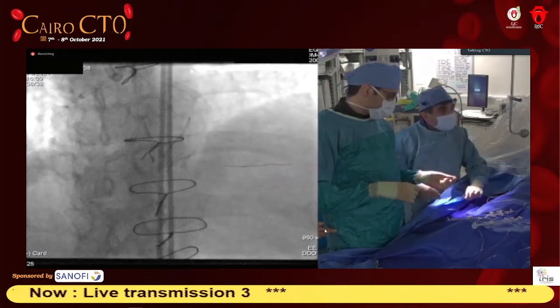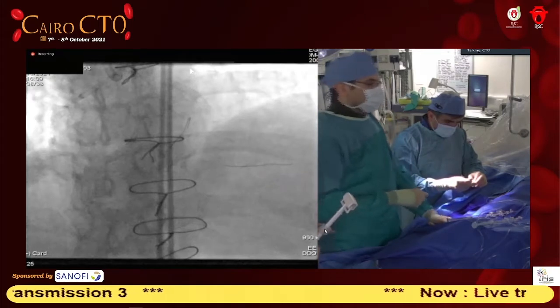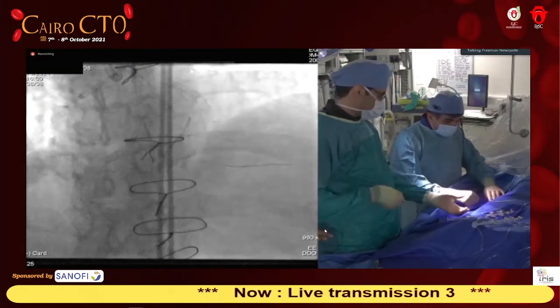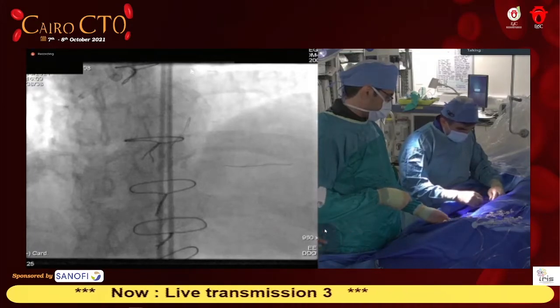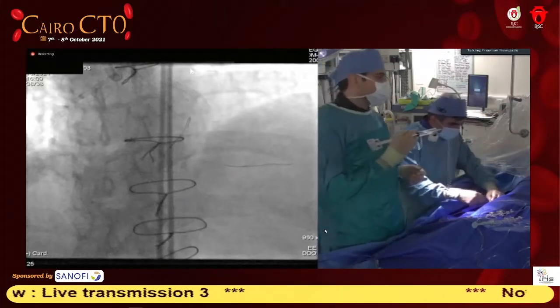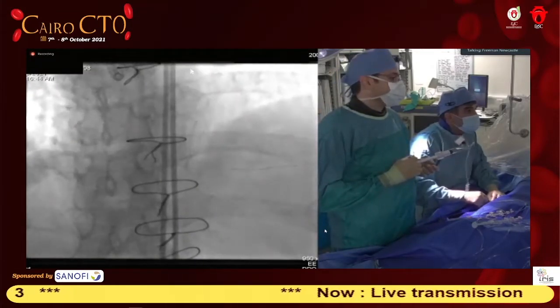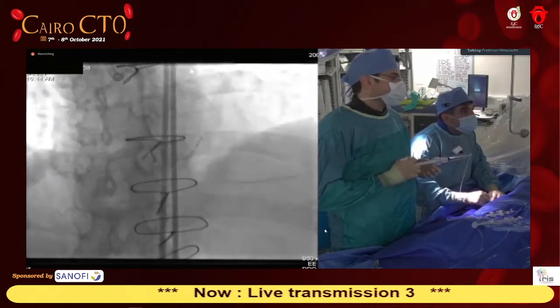If we have a problem introducing the wire after the dissection, can we do it from the saphenous vein to start retrograde again? Absolutely agree. That would be my second approach here. I stent it through the saphenous vein graft. But I think it would be okay. If I can advance it antegradely, I still have the retrograde gear in. So I'll just advance my wire and my stent retrogradely, overlap it to the antegrade. Let's hope this will turn around this severe bend.